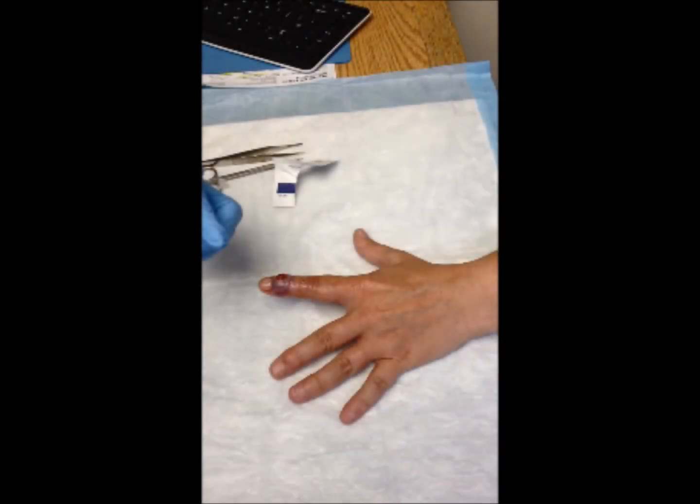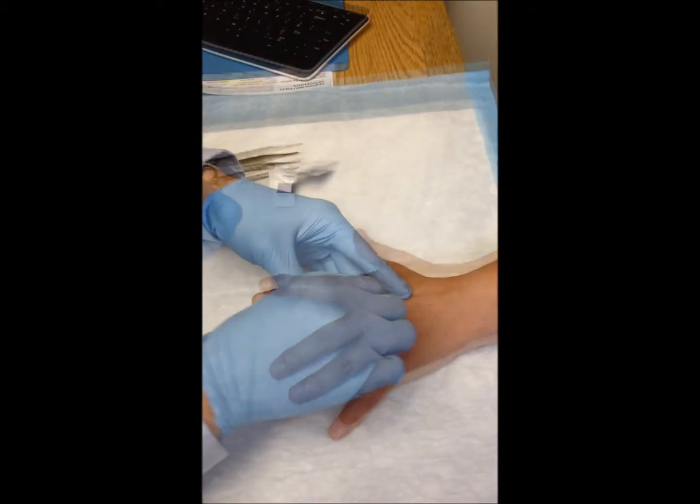The key to being able to successfully treat finger infections as well as perform other minor finger procedures in the office is to obtain complete digital anesthesia, which will be demonstrated here.